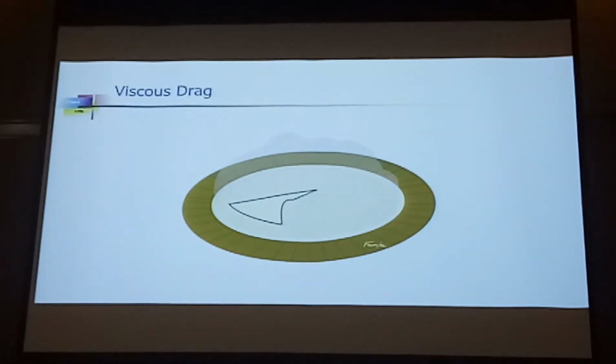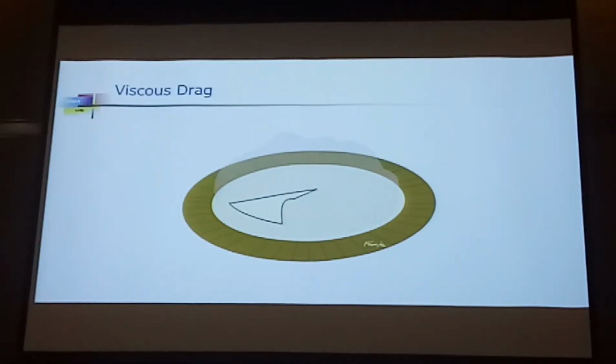Now when you do CCC with viscoelastic, you have to be careful. You don't lift up your CCC so much, it becomes a sail, and then the viscoelastic will give a lot of resistance to it, especially the more cohesive viscoelastic. The best way is to flatten it and pull along the surface. Alright, that way you don't face so much resistance.